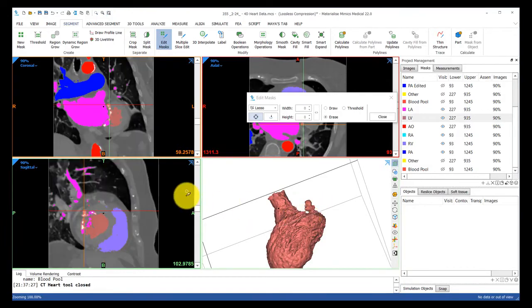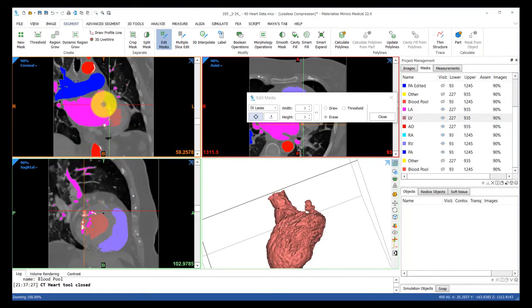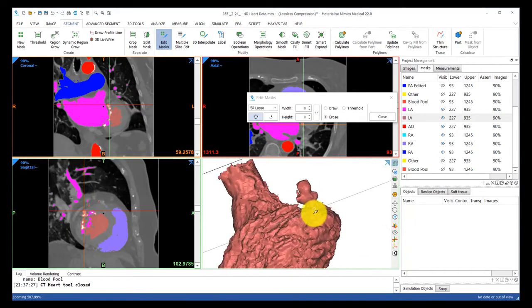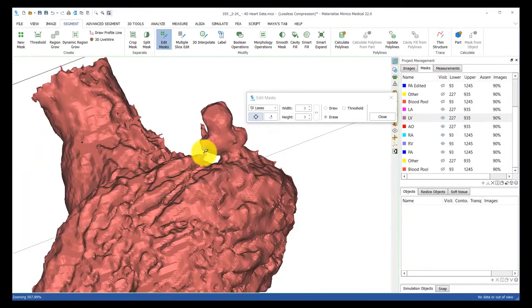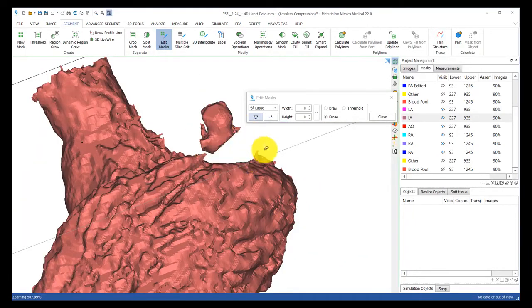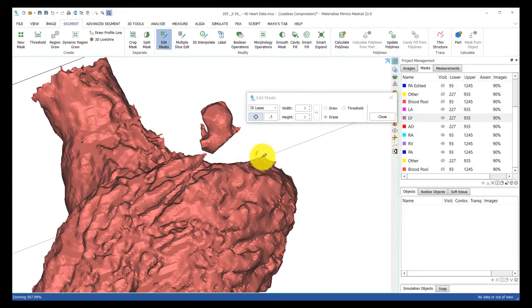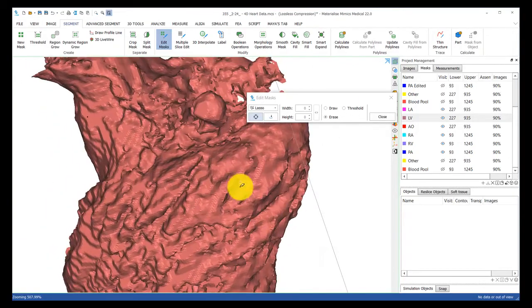It looks like I have some calcium segmented here as well. So I can hold down Shift, click on that location in 3D, and then check it over the 2D images. Indeed it is calcium, so I'll go ahead and remove it.